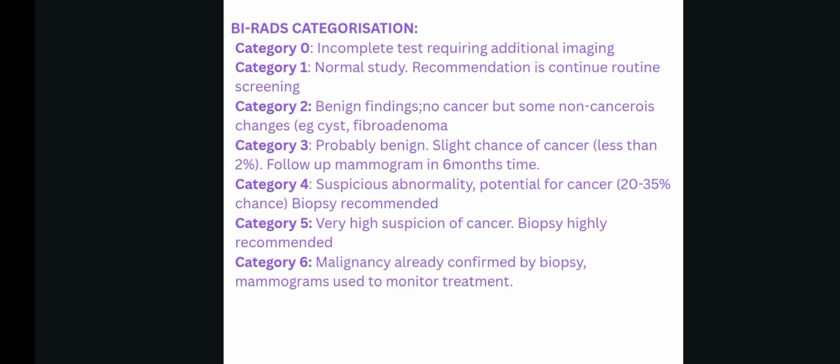These are things you may see in your mammogram result, and knowing what they mean will help you to understand the interpretation and how to equally assist the caregiver in your management. Patients are expected to be a core team in their management. This is made easy when they know what they are being treated for or what the diagnosis implies.